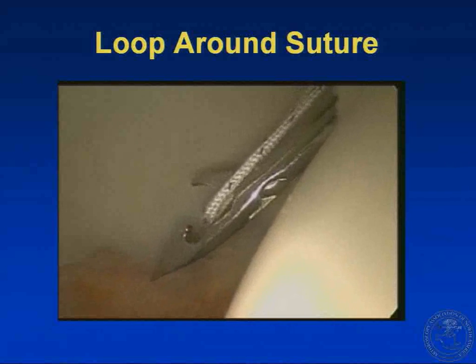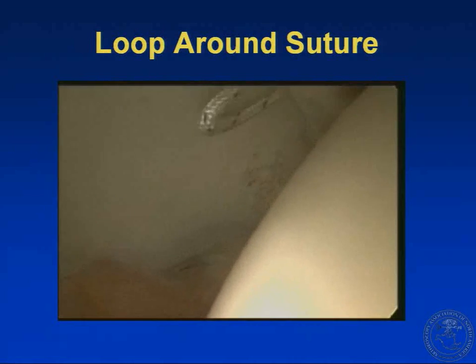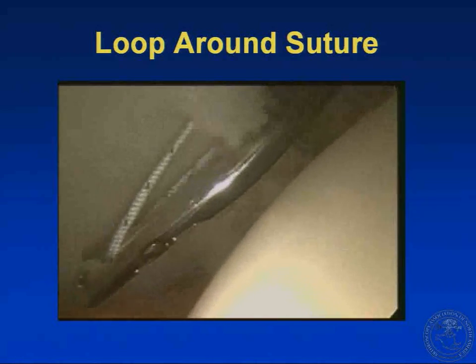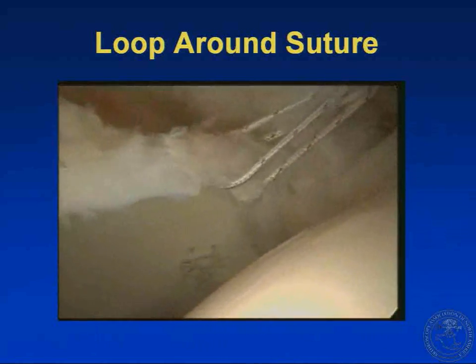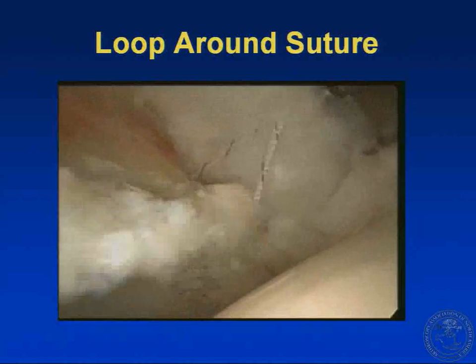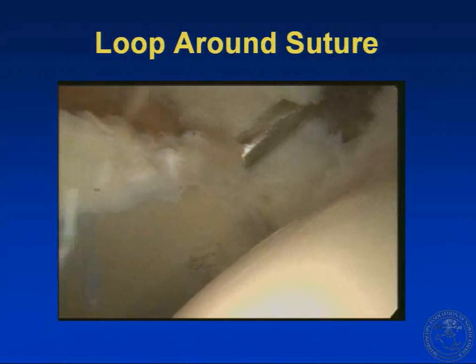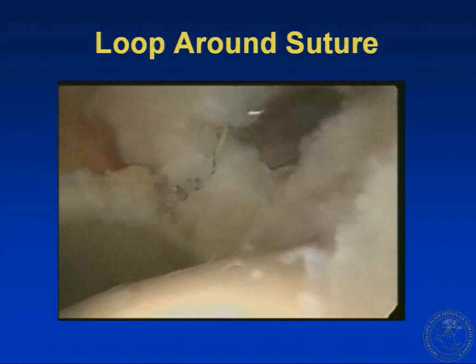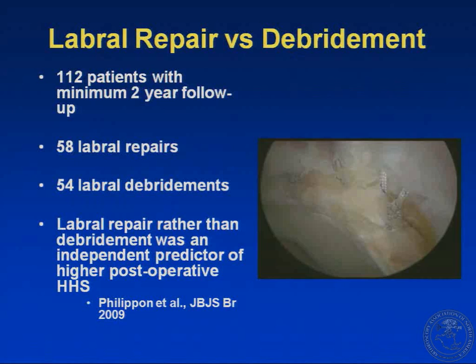For the loop-around suture, one limb of the suture is passed underneath the labrum, and the suture retriever is passed over the labrum, looping it around, followed by standard knot-tying. This can be helpful where there is a somewhat attenuated or hypoplastic labrum in an area where you're concerned about passing through the labrum. It is straightforward but may be less anatomic than a mattress-type stitch.